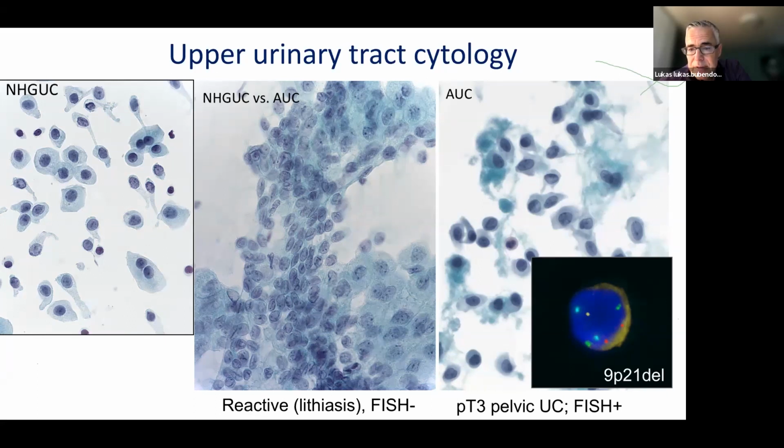Upper urinary tract cytology can be quite tricky, you know. You must be very careful not to miss things, but also not to overcall things. And we find it very useful to apply FISH in these conditions.